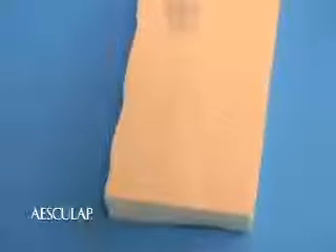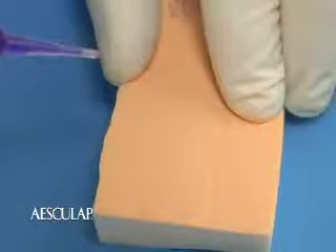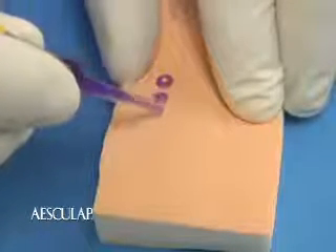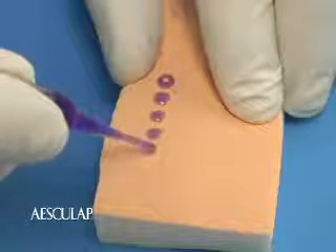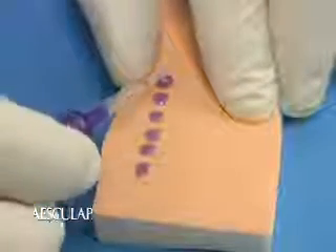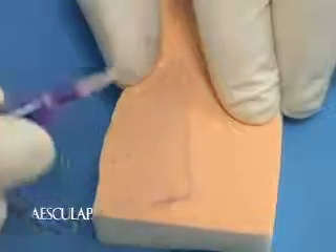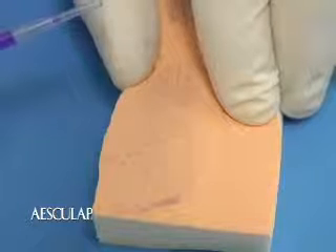There are two main techniques that can be used to apply Histacryl and close a wound. The first one we'll demonstrate is called the drop and drag method. Hold the edges of the wound or incision together. Lightly press the base of the ampule to apply a small droplet of the adhesive above the wound or incision line. Continue applying droplets in the same way. Use the neck of the applicator tip to connect the dots and drag the Histacryl over the entire wound. Only a thin layer is required.